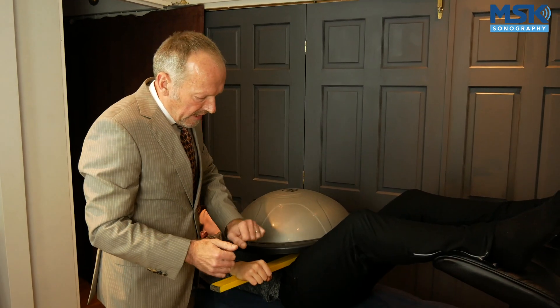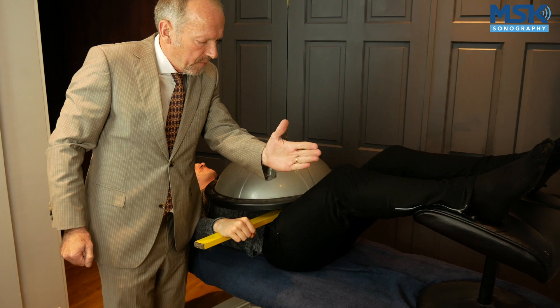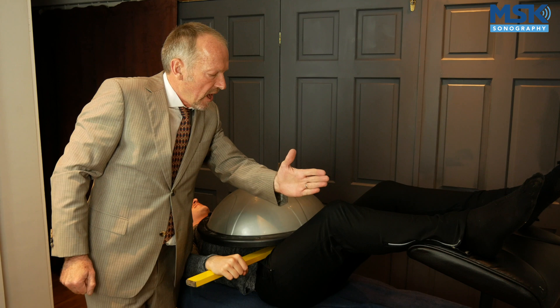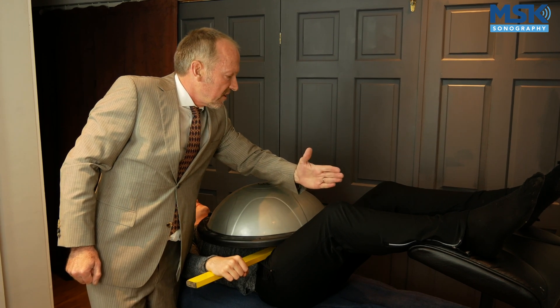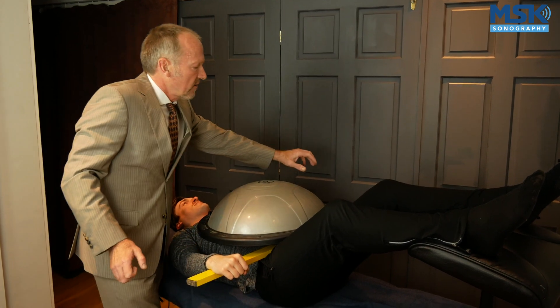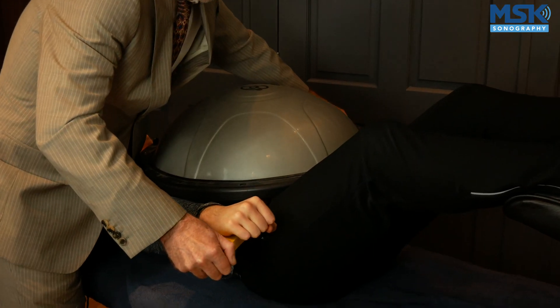So when we're looking directly over the metatarsal head, we find the line of the metatarsal head in long axis at the metatarsophalangeal joint, then we come off the bone into this region here. We should simply be able to easily see the bursa, the ligament, and the nerve. But it unfortunately doesn't work as easily as that, because as we go laterally the actual metatarsal heads are more proximal, which skews our view a little.